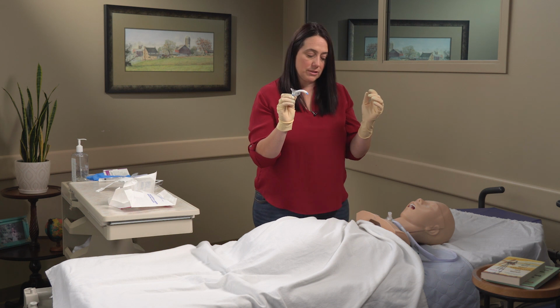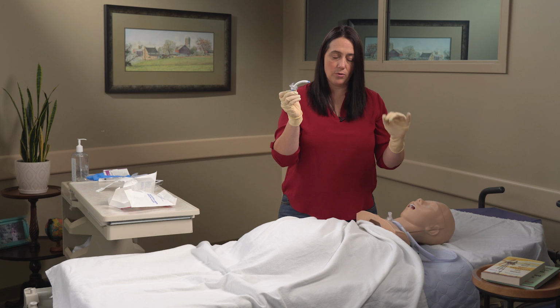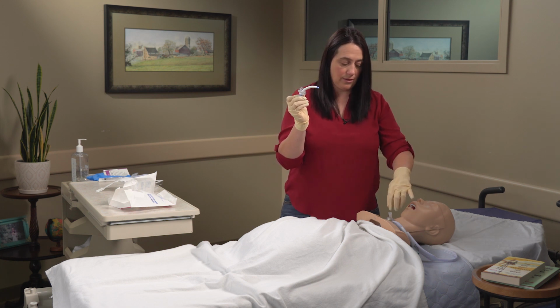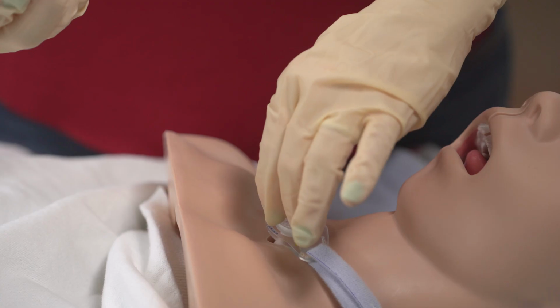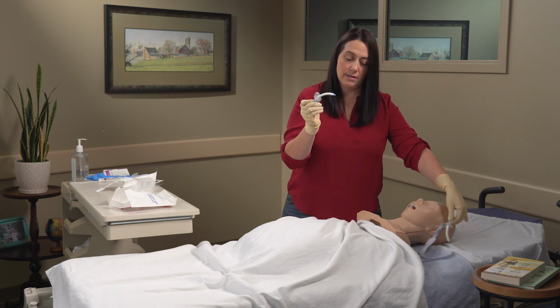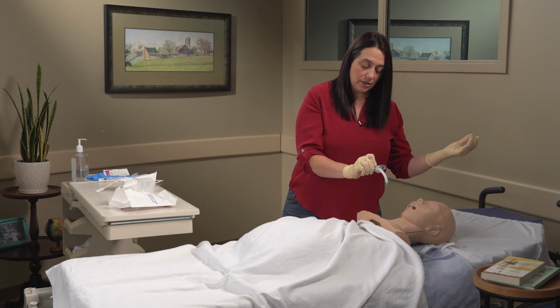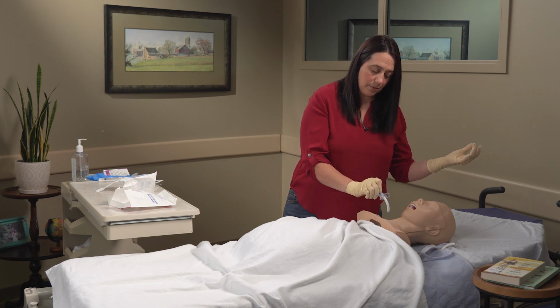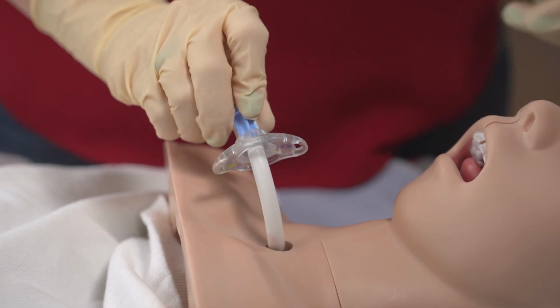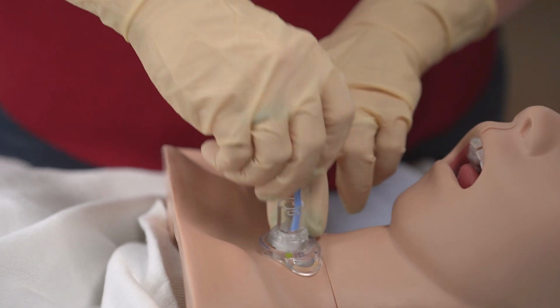When I'm coming to the patient, I'm going to have my sterile hand. This one will not be sterile once I touch the old trach. So I'm going to go ahead. All right, I'm going to take the old trach out now. So I'm going to be turning and twisting as I go. Notice I'm right-handed, so I'm standing on the right side of the patient. When I start this movement, I'm coming in at this angle, side to side, and then I'm turning as I enter. I've got it placed.